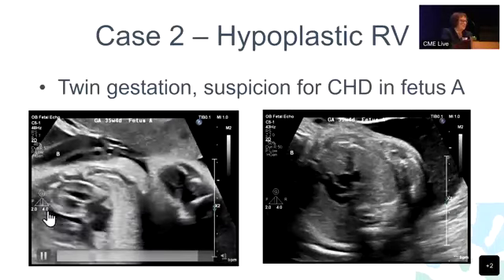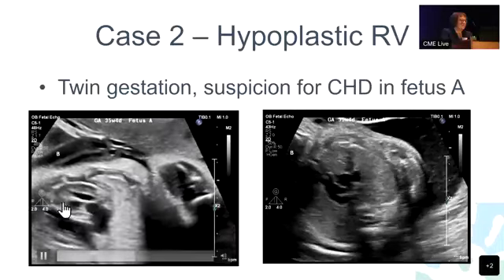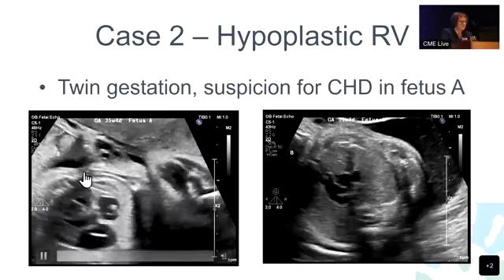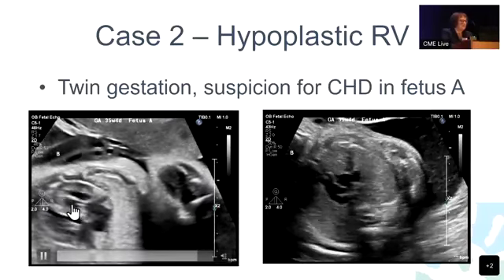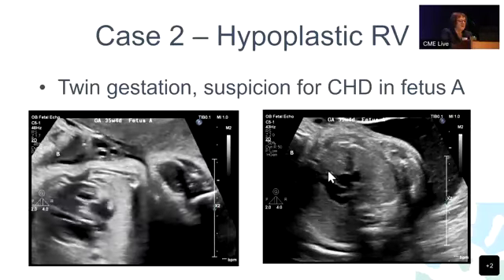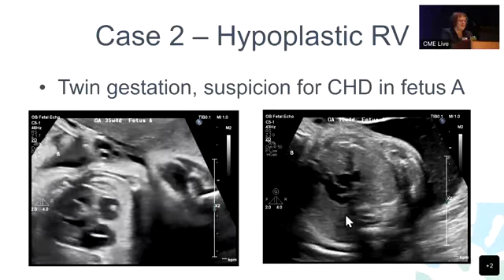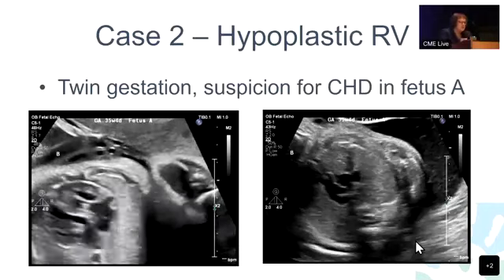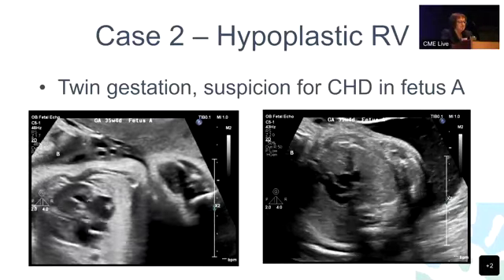You could see a normal left ventricle right here, and a severely hypoplastic, hypertrophied, somewhat hypoplastic and dysfunctional right ventricle right here. Her pulmonary artery and pulmonary annulus size are really quite normal, but there was pulmonary or near pulmonary atresia with a very, very little bit of flow through it.